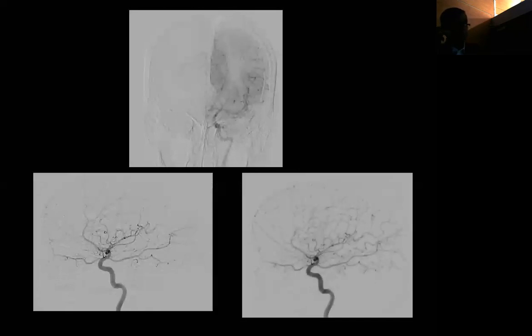This is the left internal carotid artery. You can see the anterior cerebral artery A2 segment is pushed to the left side. Still, it is supplying some of the feeders to the right side. You can see some blush here, which means there are leptomeningeal feeders coming from the left anterior cerebral artery, and the supply filling even part of the meningioma through the ophthalmic artery. This is the ophthalmic artery, and this is the retinal blush here. So this is a large dural branch because of the demand of the tumor.